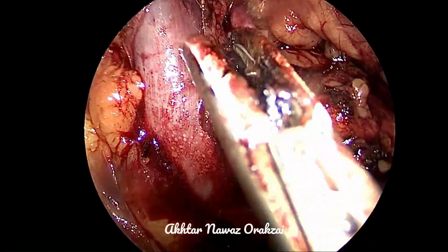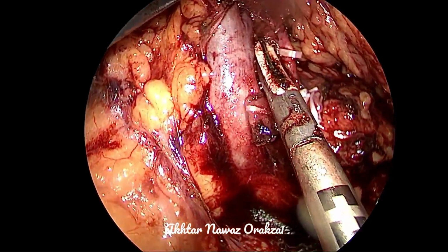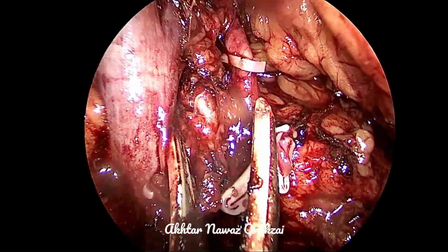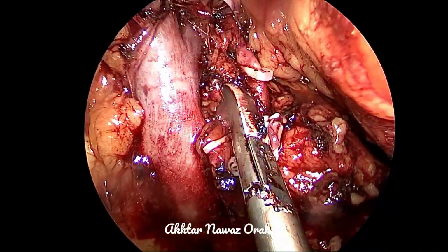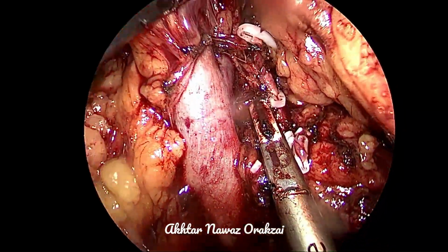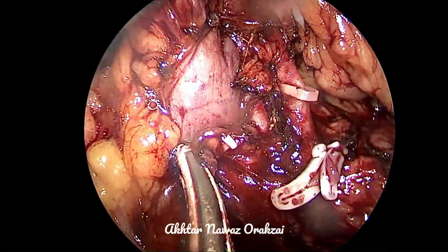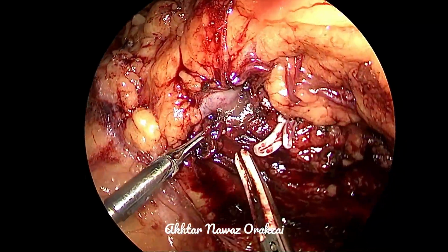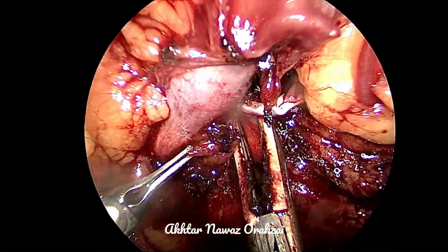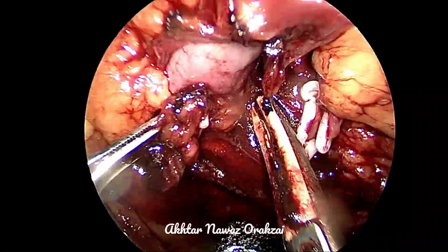The vein did not collapse. So we dissect posterior to it, but this time we are lucky because the origin of the artery from the aorta this time is the usual origin, which means that it is posterior inferior to the vein, so it is easy for us to dissect it, clip it, and then complete the procedure. So we have found another branch as well.